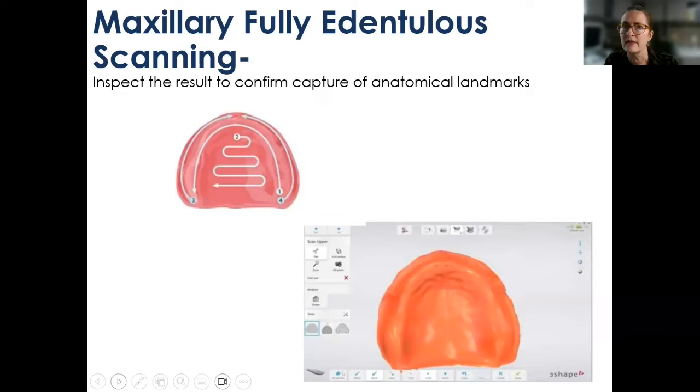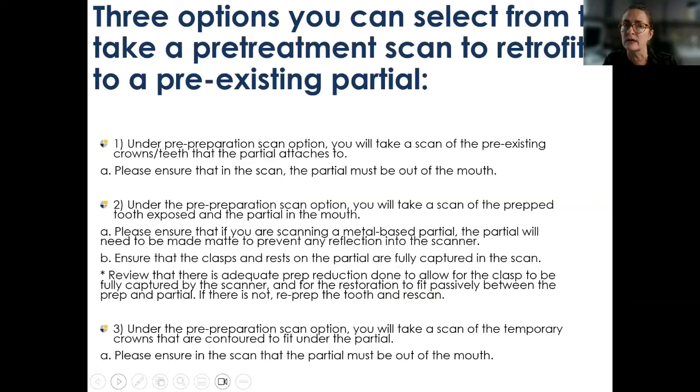And I will say that as far as going to fabrication of dentures right now from an intraoral scan, the process that we as a laboratory prefer is scanning an impression, whether that be a wash impression inside of your denture or an impression inside of a custom tray. So what you may get back from this particular type of intraoral impression, or scan rather, digital impression, might be the custom tray itself that you would take the PVS impression in to start that next process.